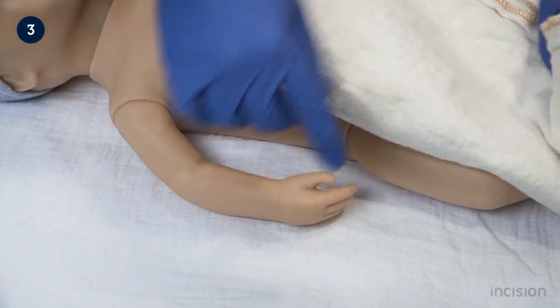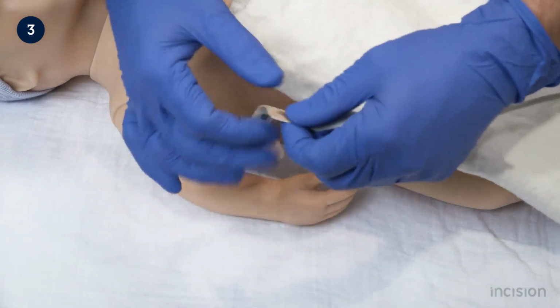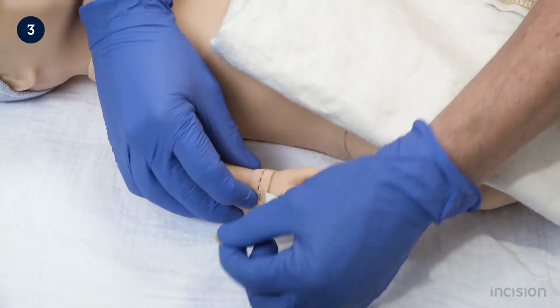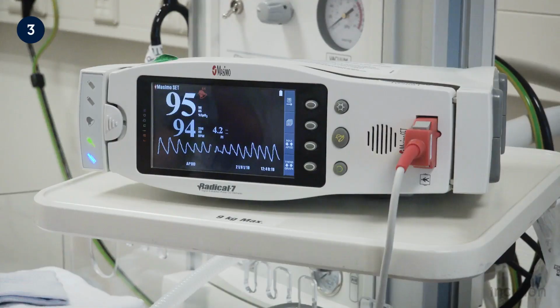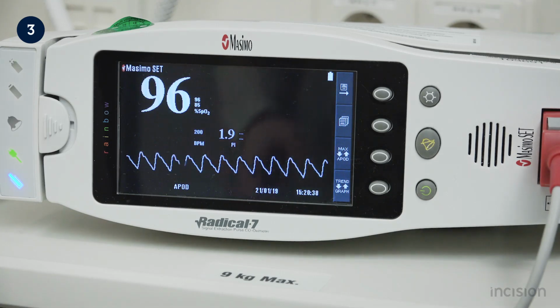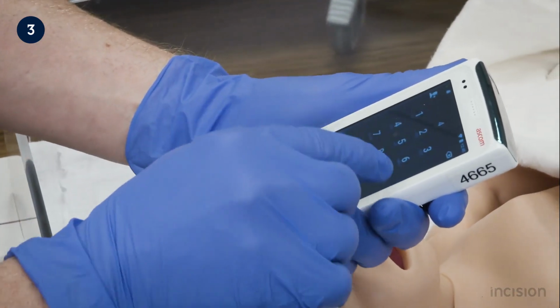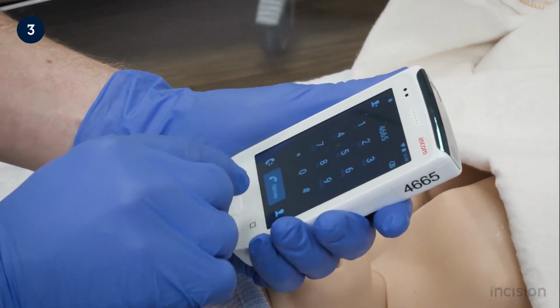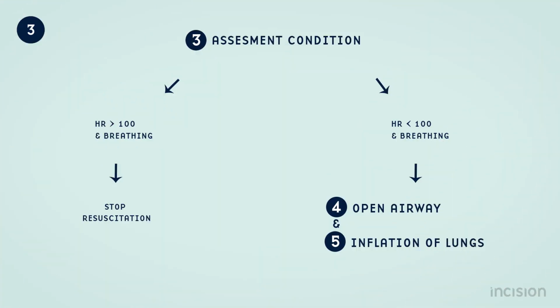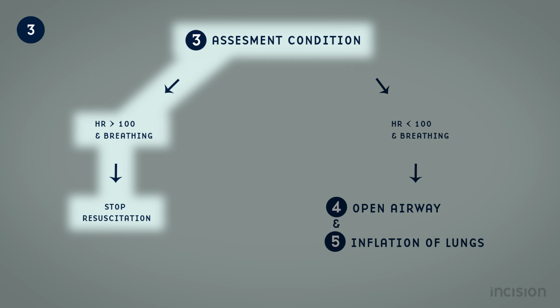If available, newborn oxygen saturation should be monitored. A saturation monitor applied to the right hand or wrist can give an accurate reading of both heart rate and oxygen saturation. Heart rate and breathing are measured every 30 seconds until resuscitation is no longer needed. The healthcare professional may call for help at any time during a resuscitation, and it is imperative to do so when required. If the heart rate is greater than 100 beats per minute, no intervention is required.